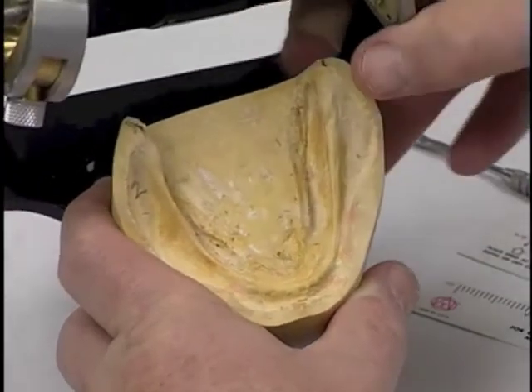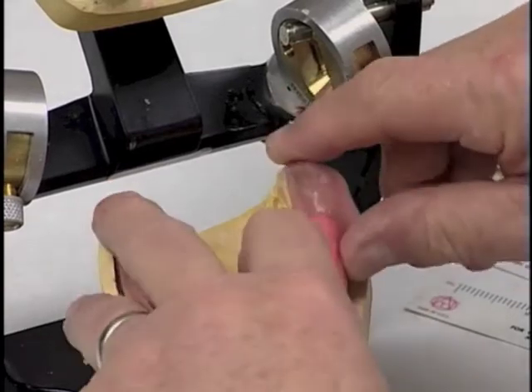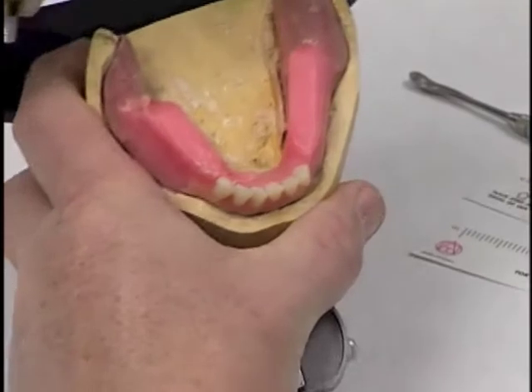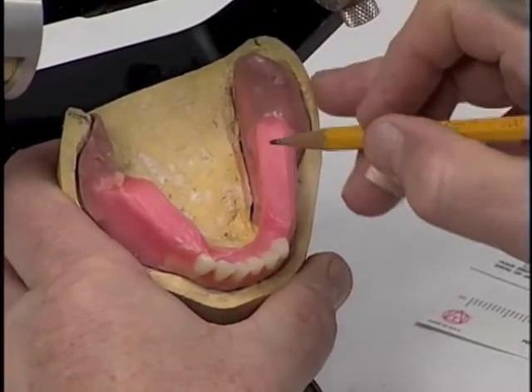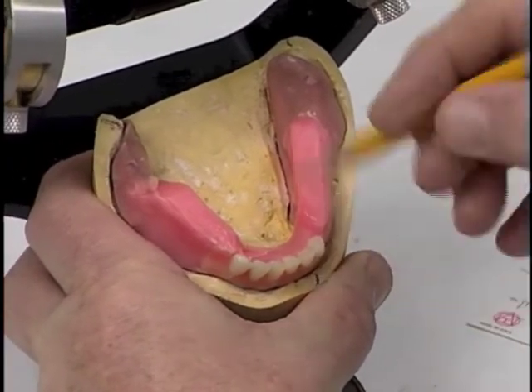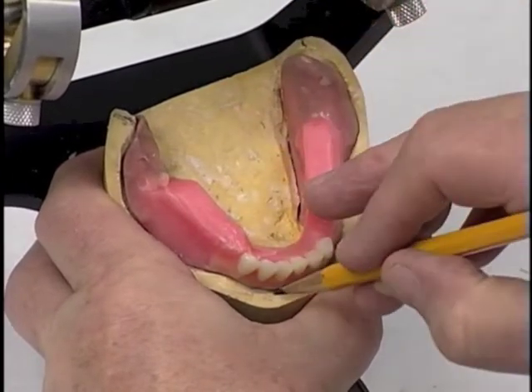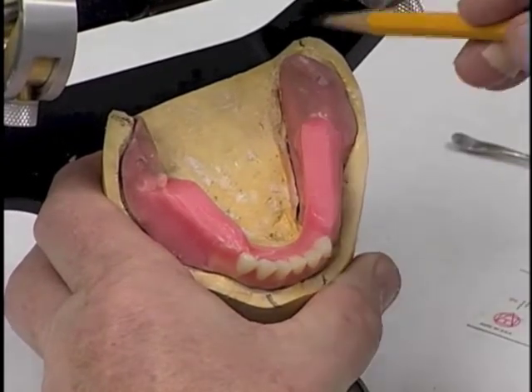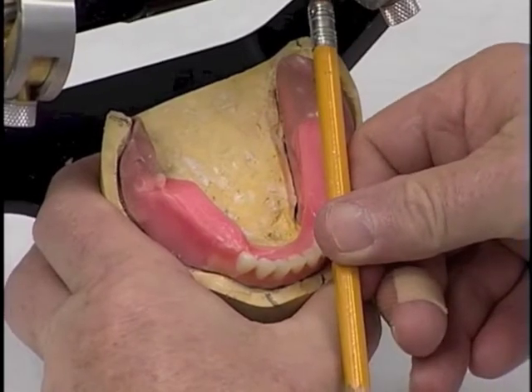Once we have done that, then we can put our base plate with the anterior arrangement on it back in place, and we can extrapolate now down the ridge through the canine and put another mark on the labial, on the land and the labial region. Do the same on the other side, so that now the line between this point and this point should represent the crest of the alveolar ridge.